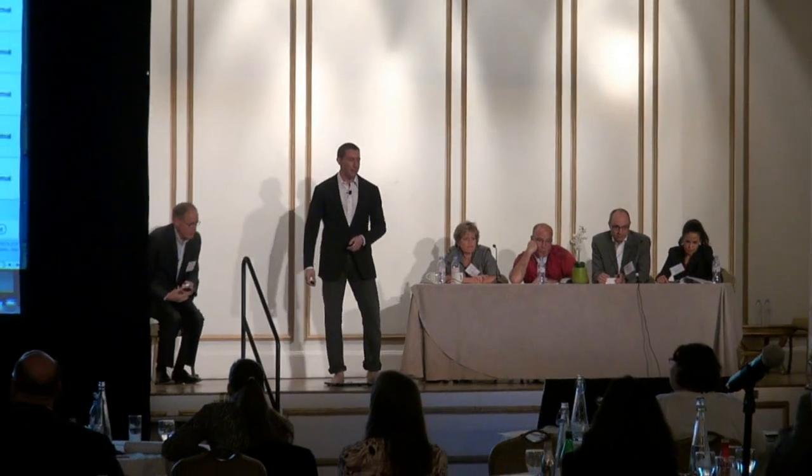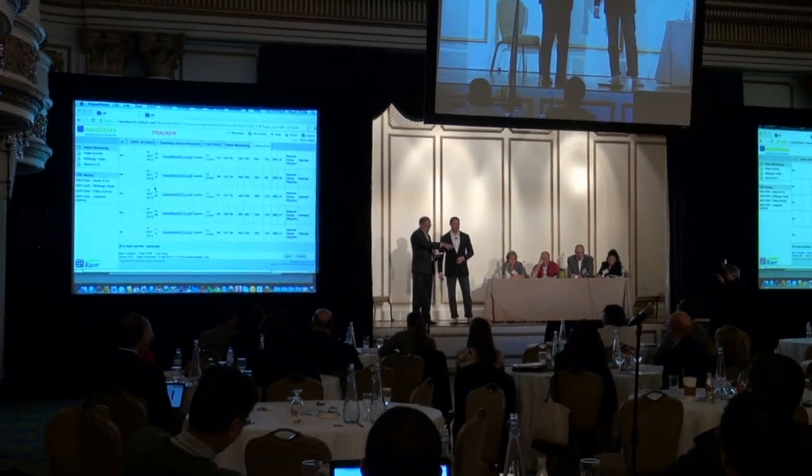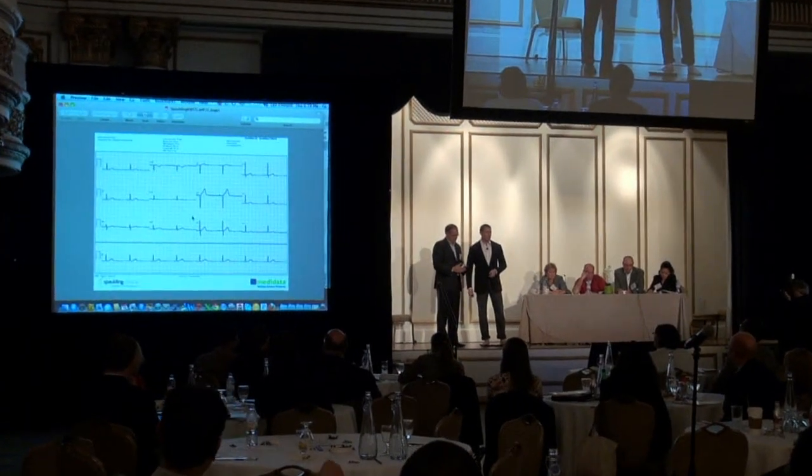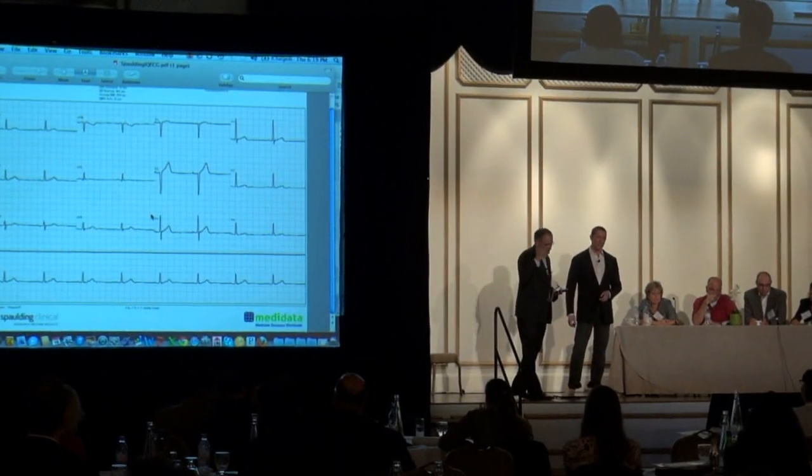So with that, actually maybe we could switch over to our systems. How's your EKG going? I have my ECG I've been taking. I did transmit it. Ours is a cloud-based system, as Medidata's is. And now you should be able to see on your screen, first for me, you can pull up one of the PDFs. There's my ECG that I just sent in.